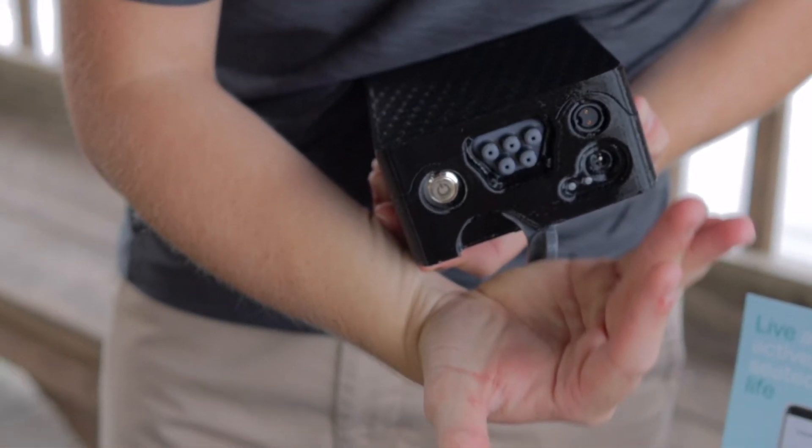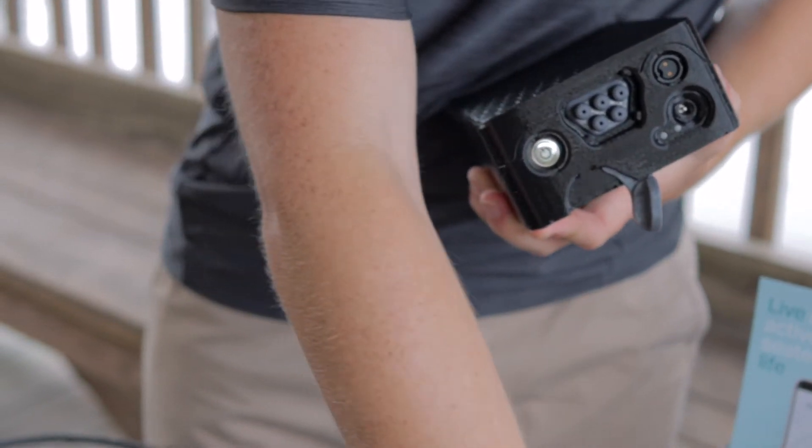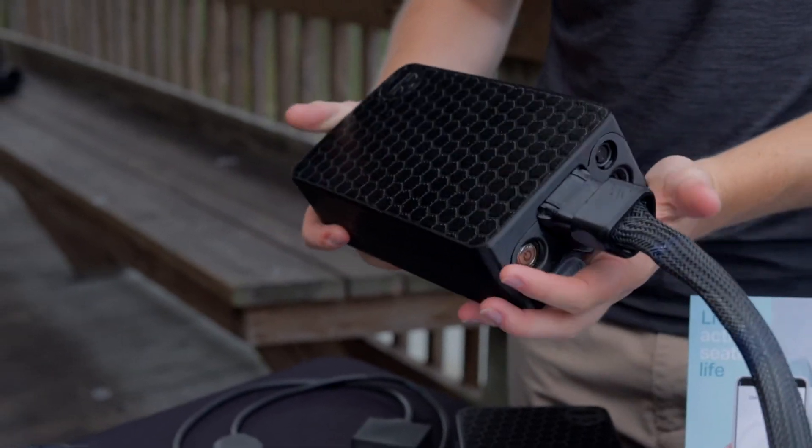To connect your cushion to the control unit, first you must open the hose lock located at the bottom. Next, fully insert the hose and finish by closing the hose lock.